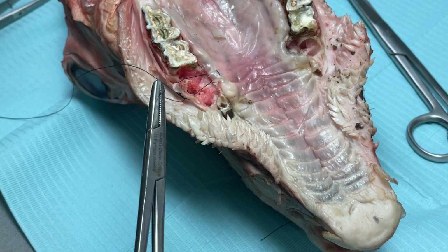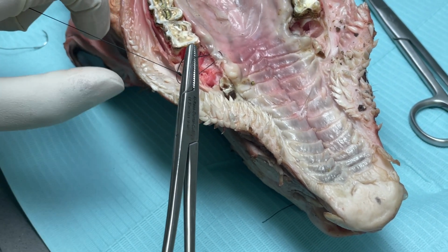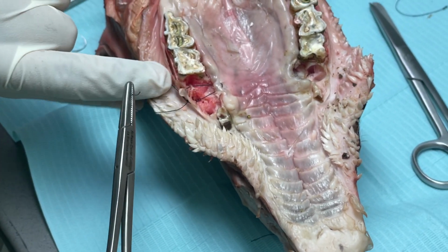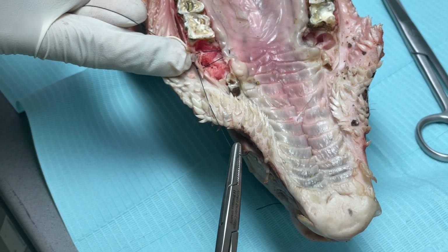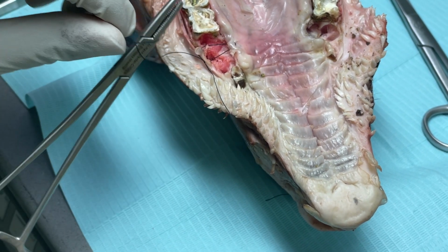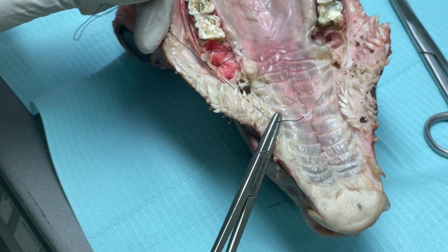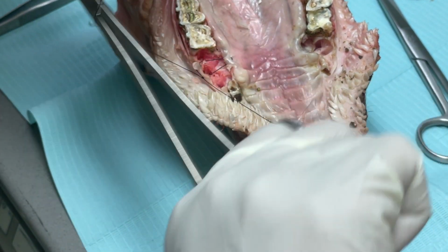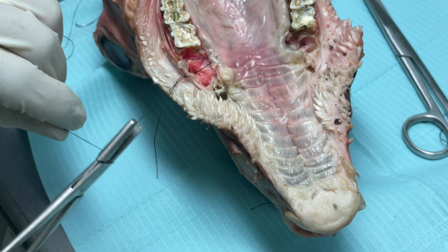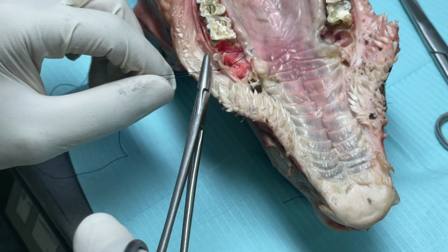Then see, if you keep your finger and guide it here, the knot will come towards that side. Okay? Fine? One anti-clockwise. One more clockwise. Okay, this is how it is done.